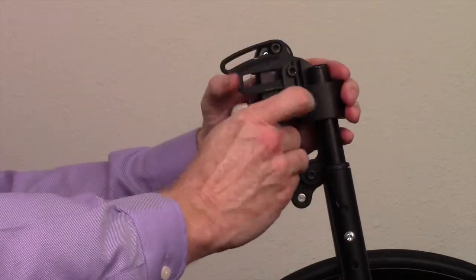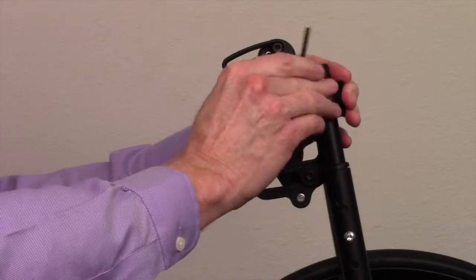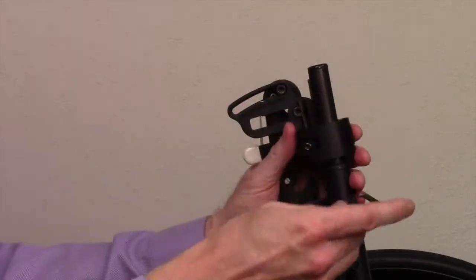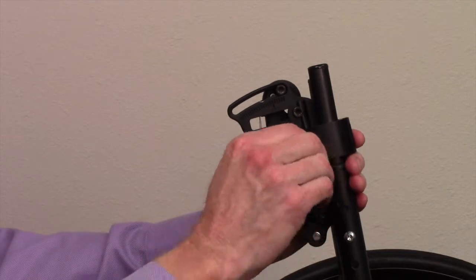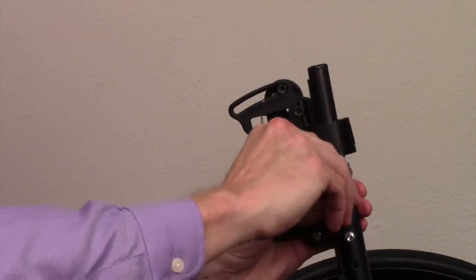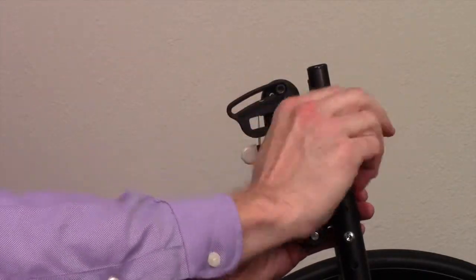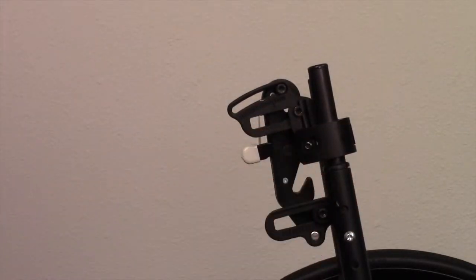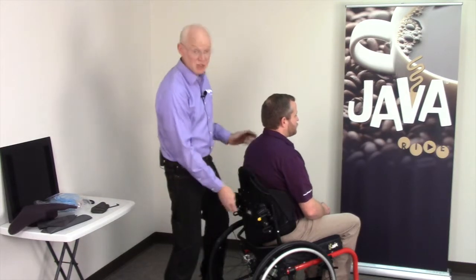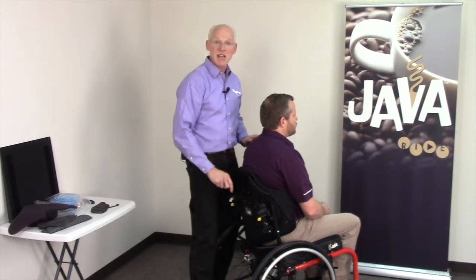With the back installed, loosen your hardware, adjust your height. Starting to look better. Things are starting to look better. I've got him in a, this is a tall Java back.